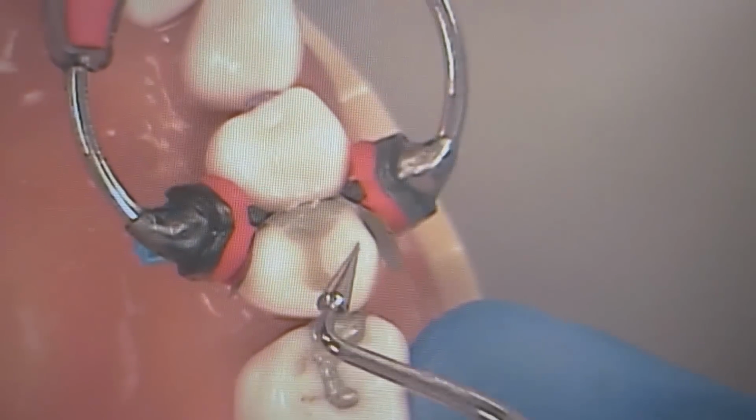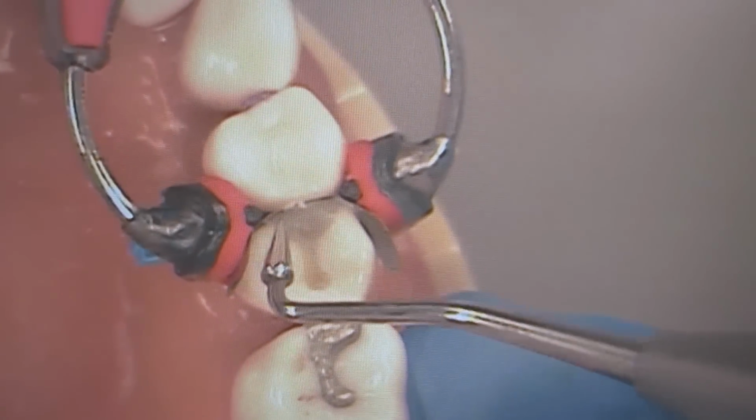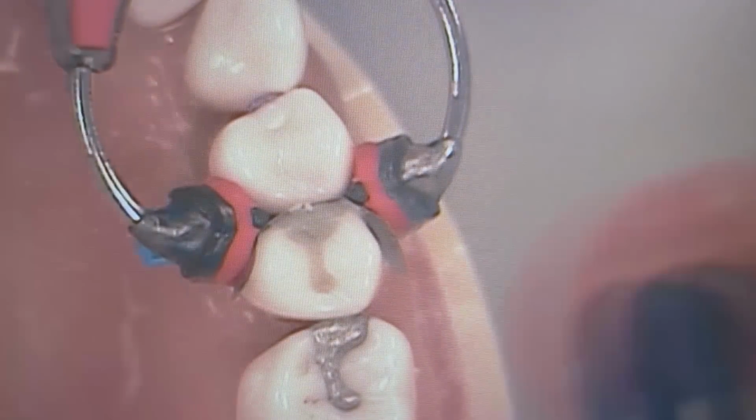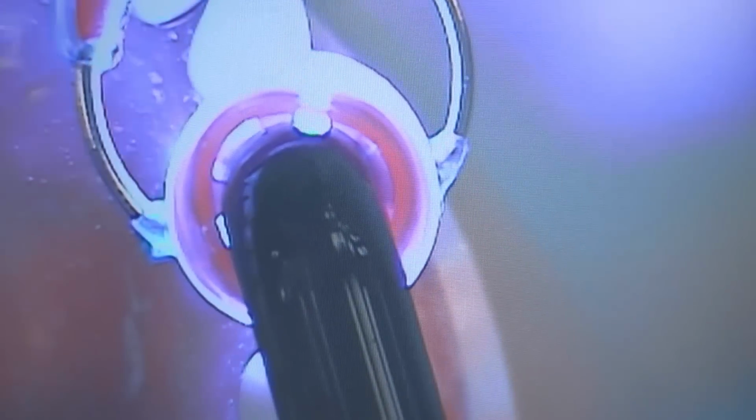That looks great. I've been doing it the opposite way. Make sure you remove all that excess composite before you cure it. Like the marginal ridge, trying to take off the excess of that, but then just ending up with the finishing version, like with forceps?